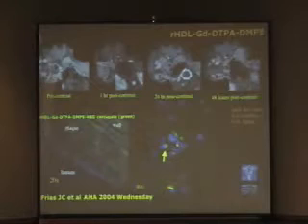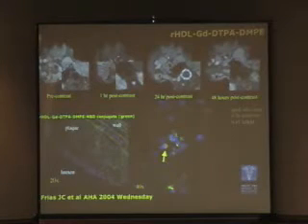Let me see what I have. Okay, I guess, because PK is here, and we're very excited about our work with the HDL-like particle. This is using a natural lipoprotein to carry the gadolinium and to target it specifically to the vessel wall itself. I know Sam Semikas is also in the audience. He's been doing work with nuclear imaging and molecular imaging. So this is the MRI approach.